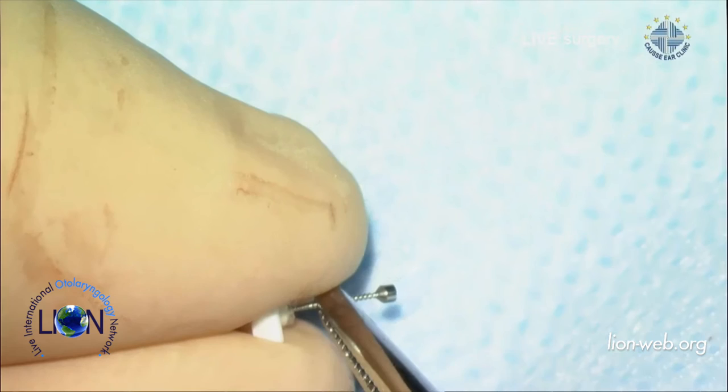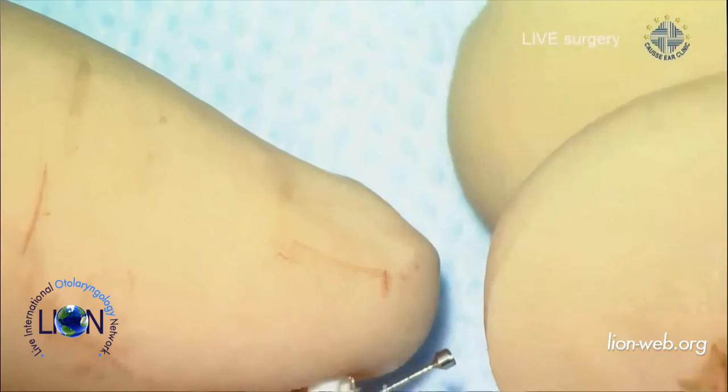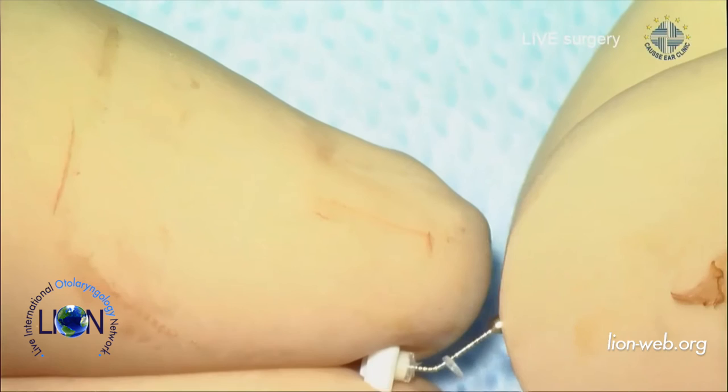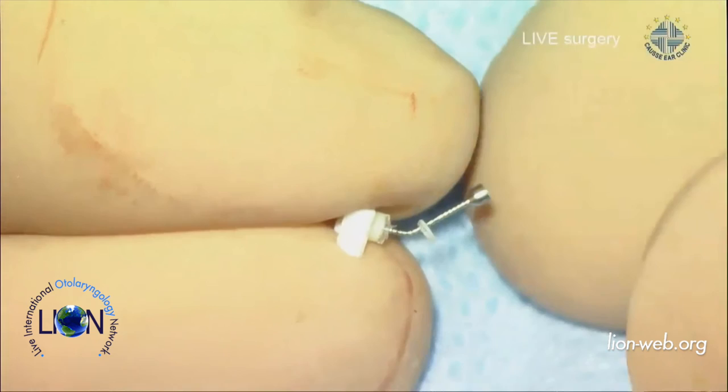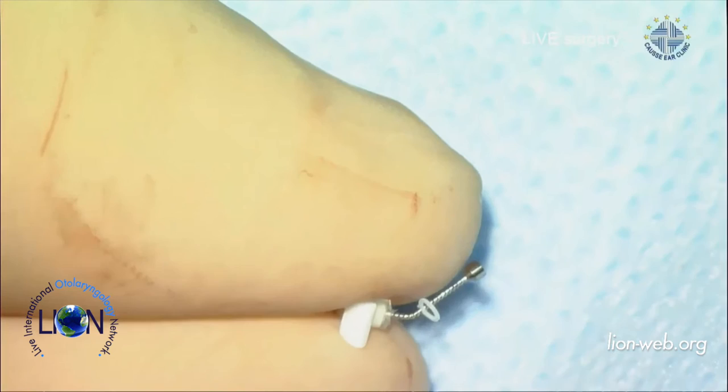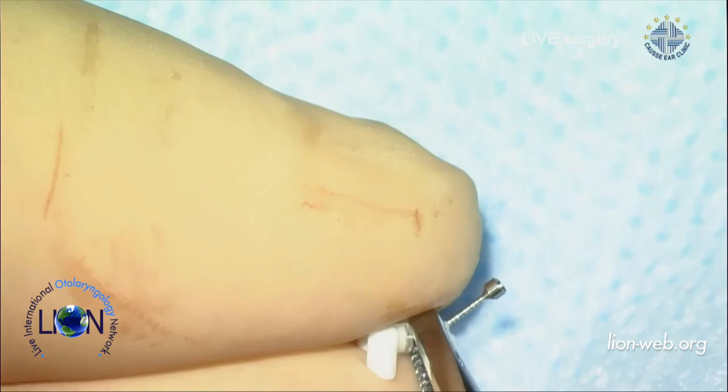So one side like this. Okay, this one is more difficult to bend than the Medtronic one, because it's very malleable, as you can see. So it's not easy to make it. It's not absolutely necessary, but in this case, I think this will help. Difficult to make it stabilize. There we go. Now we have the S shape.